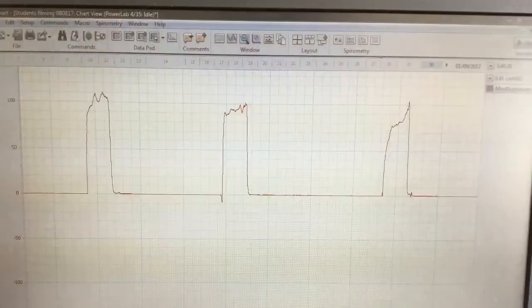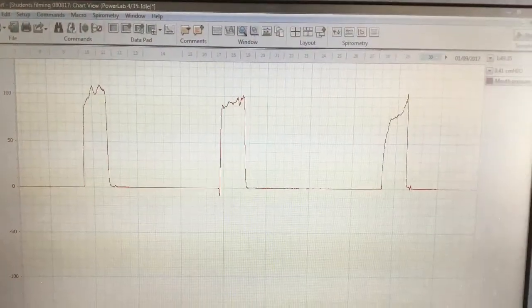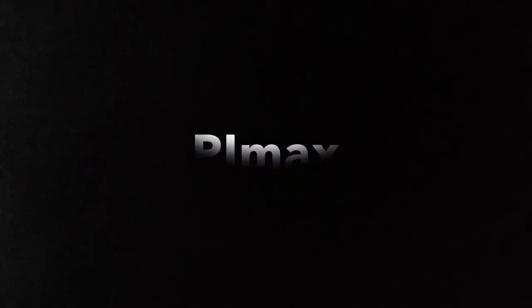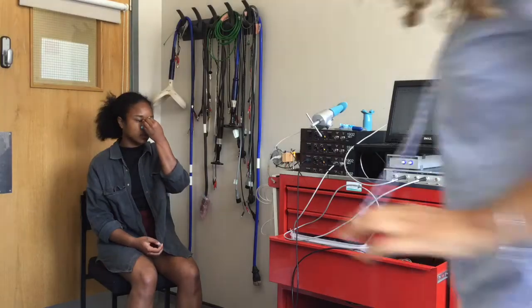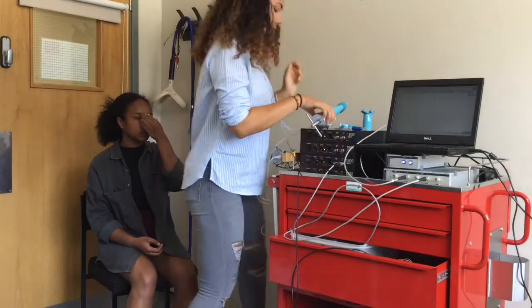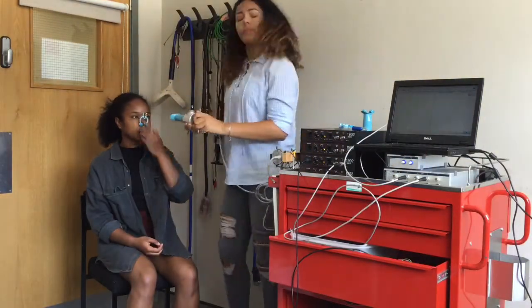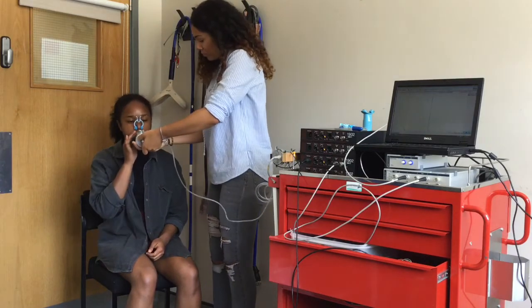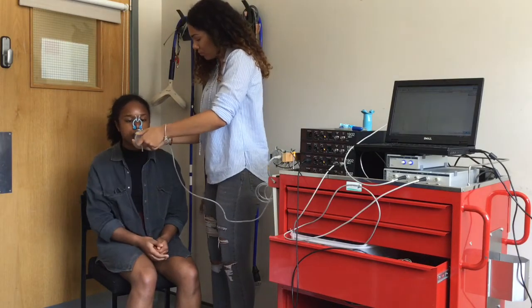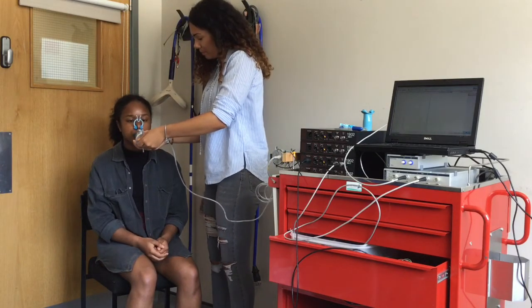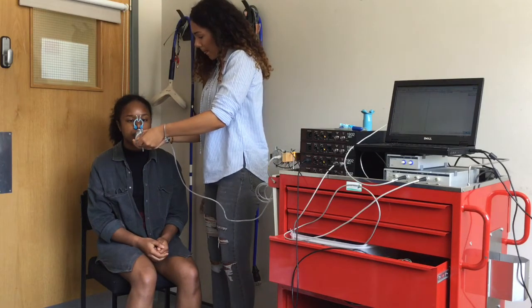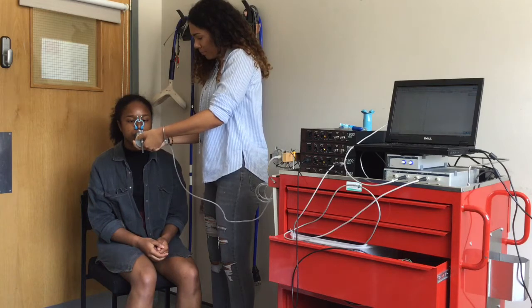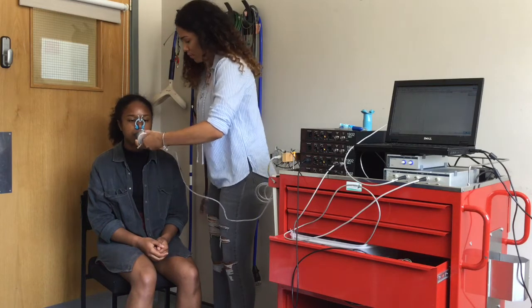In cases where patients may have suffered a paralysis in muscles around their mouth, support in pinching their lips when using the mouthpiece may be needed to avoid leaking of air around the mouth. The maximum value of three maneuvers that vary by less than 20% of each other are recorded.